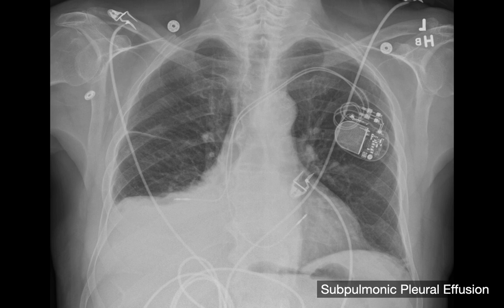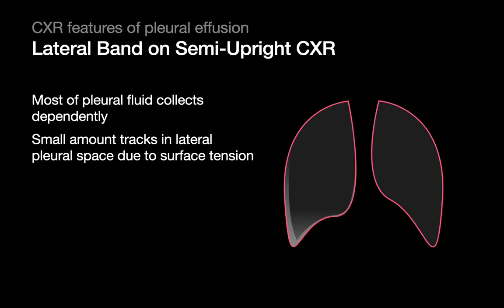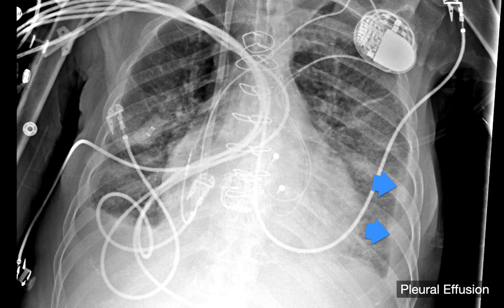Here's an example of a subpulmonic pleural effusion that looks like just an elevated right hemidiaphragm, but all that opacity inferior to the right lung is actually pleural fluid, likely a hemothorax in the setting of a malpositioned cardiac conduction lead. Another way pleural effusions may manifest is as a lateral pleural band — a layer of fluid between the rib cage and the lateral margin of the lung. On portable chest x-rays, you may not always see blunting of the costophrenic angle; the lateral pleural band may be the next feature you see.